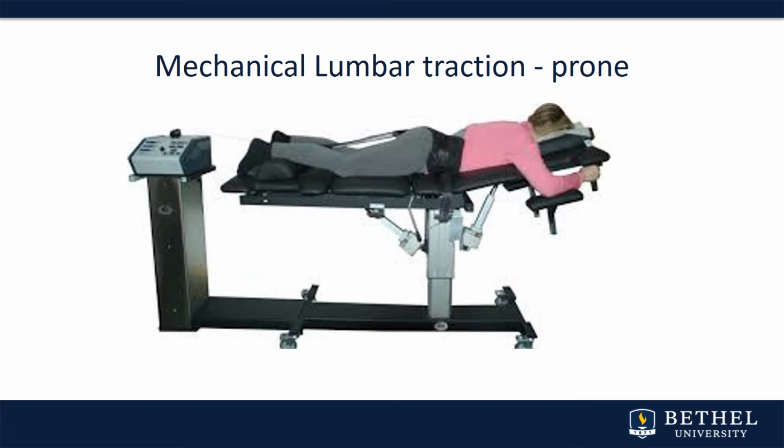Mechanical traction can also be done prone, especially if somebody's got a disc that's prolapsed posterolaterally, or maybe not prolapsed, maybe just a little bit of herniation, not completely extruded out. This is a great position, and then we add traction into it. You'll find out later in therapeutic interventions too that this is a position of exercise that we utilize oftentimes with disc patients.